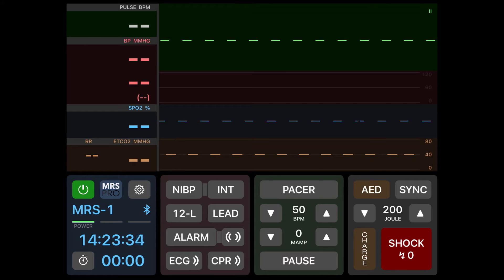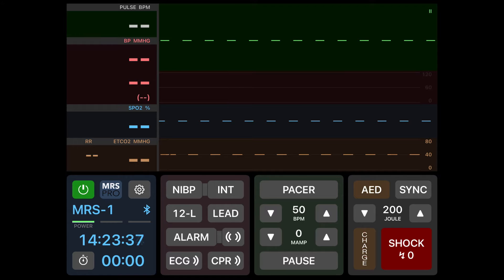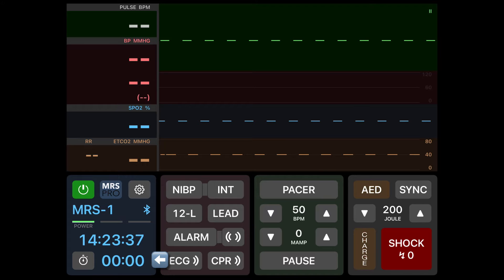At the bottom of the screen from left to right you have the power button, the system control button, a real-time clock, as well as a stopwatch that can be used to do your intervals during CPR.